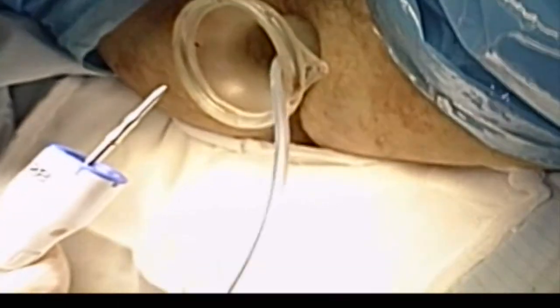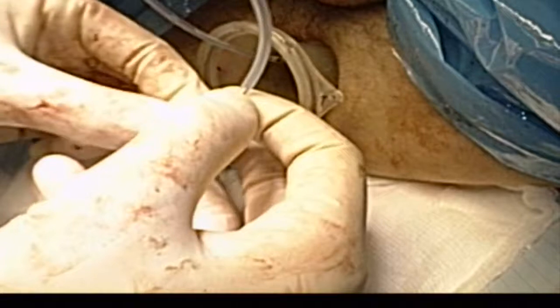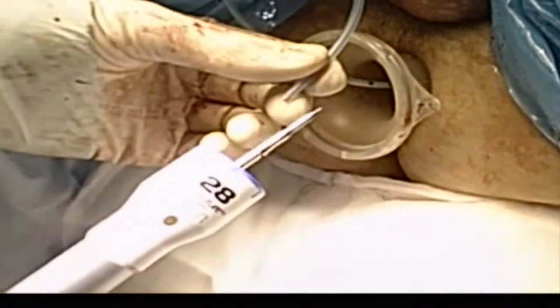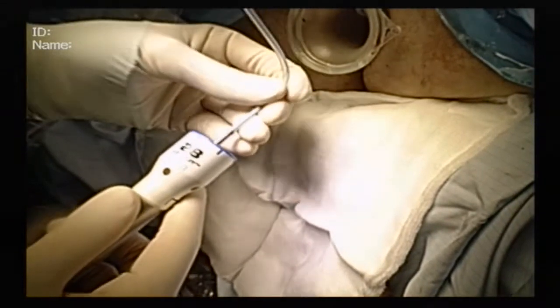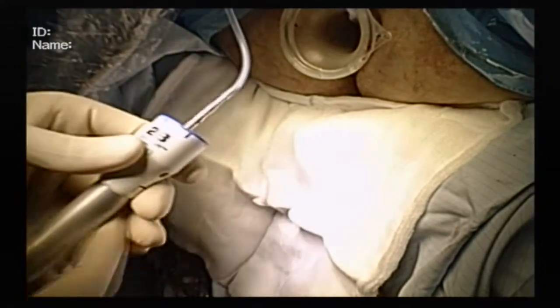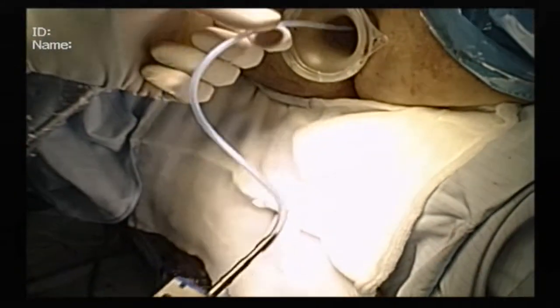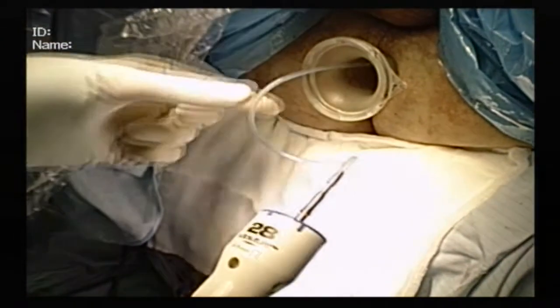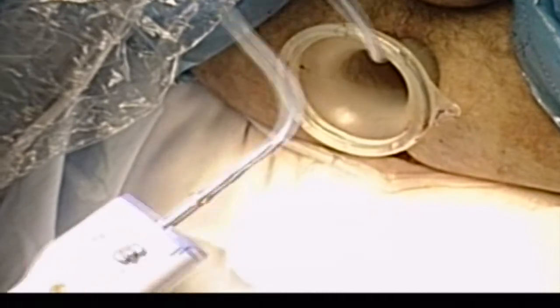The next step is to feed the spindle of a standard 28mm circular stapler into the distal end of the drain. The drain is then advanced through the purse-string into the abdominal cavity, guiding the spindle of the attached stapler through the centre of the purse-string.